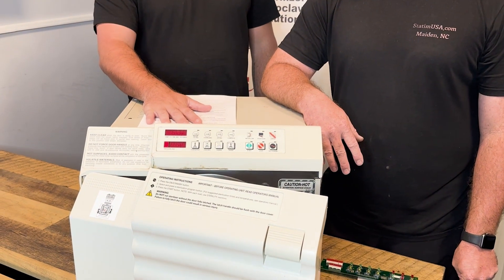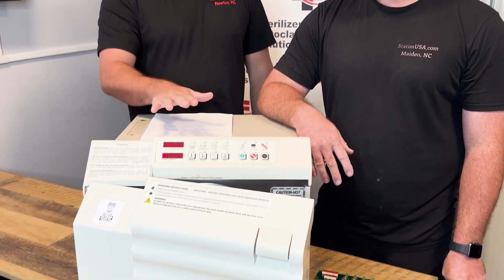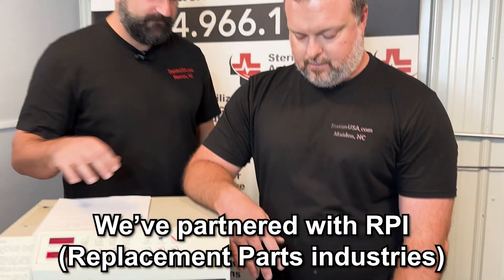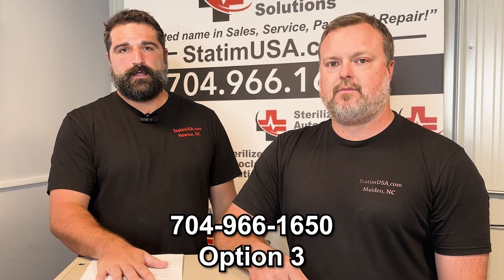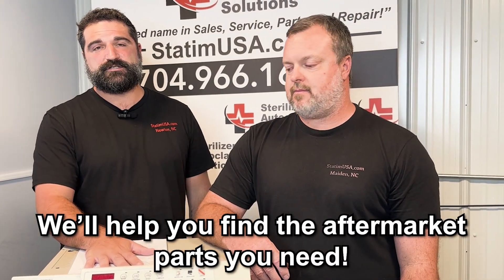Something I would like to point out here is that this is what we call in the industry an M11 old style. If you call Midmark, Midmark will say they no longer support this product and they no longer supply OEM parts for this product. That is 100% true, but that does not mean you cannot repair this unit. We partner with a great aftermarket company called RPI, and they do make parts for this — including the display keypad. So give us a call at 704-966-1650. There's a very good chance that we can get an aftermarket part and help you fix this unit.